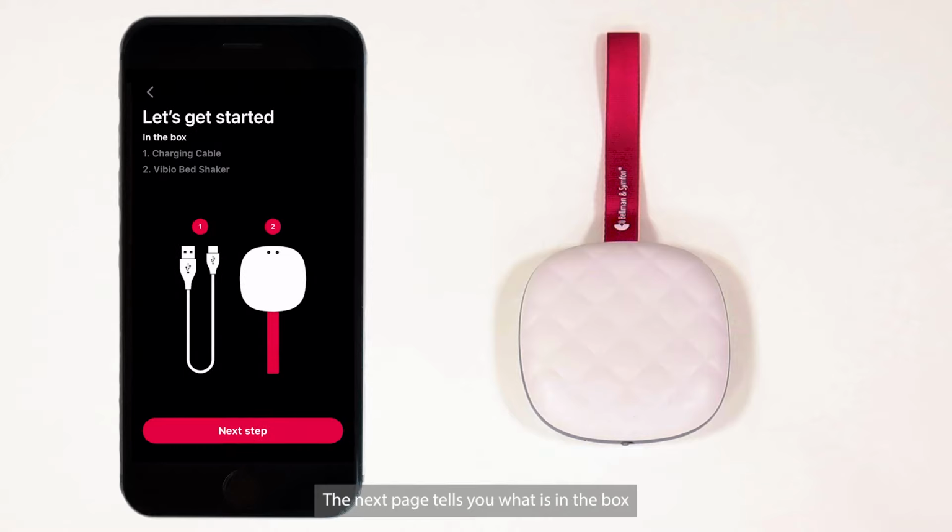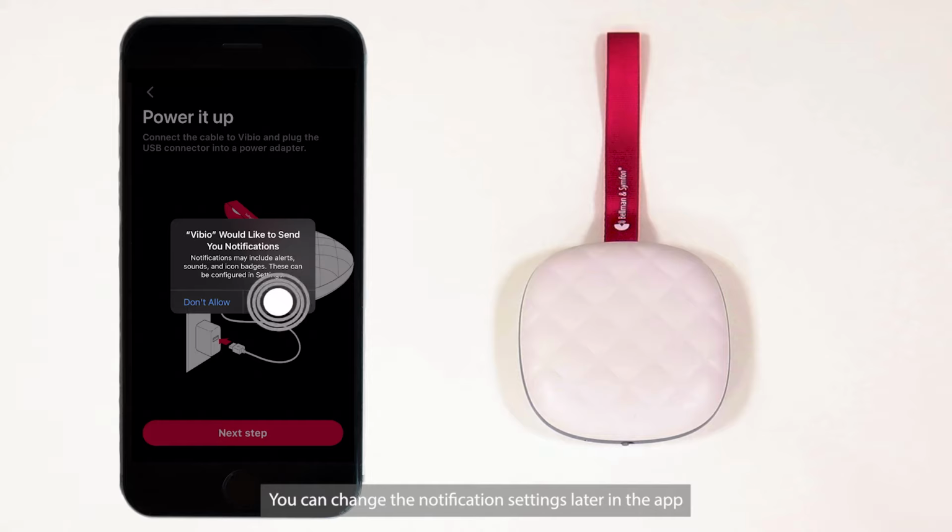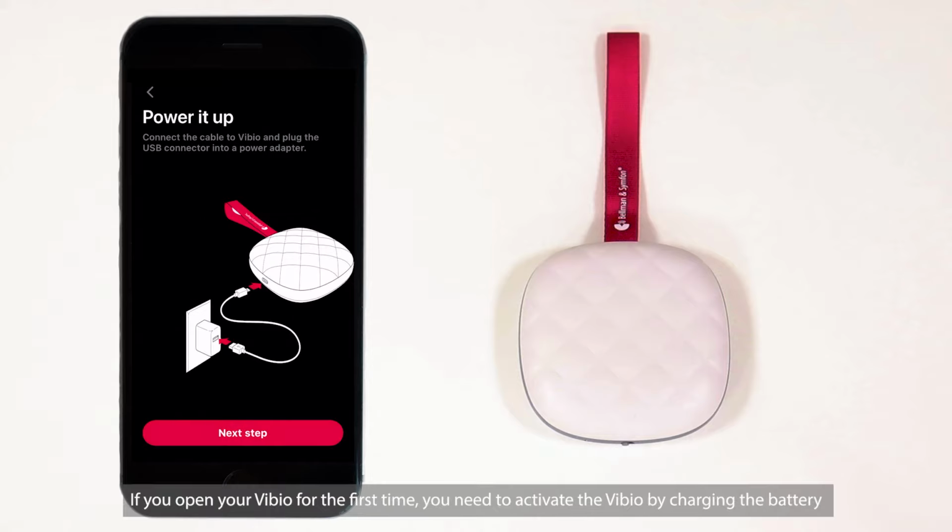The next page tells you what is in the box. Press Next Step. A message will pop up saying Vibio would like to send you notifications. You must press Allow for proper setup of the Vibio. You can change the notification settings later in the app. If you open your Vibio for the first time, you need to activate the Vibio by charging the battery.